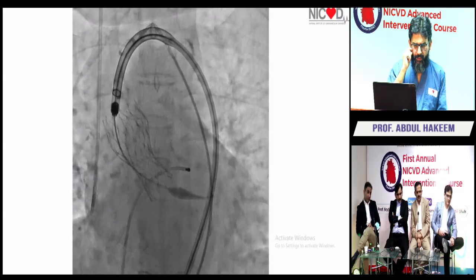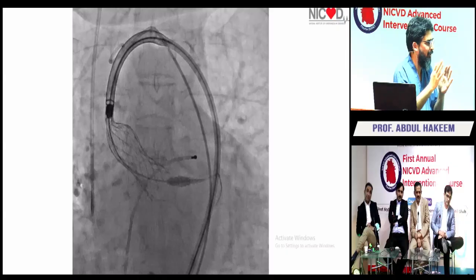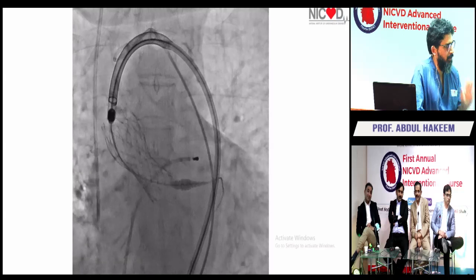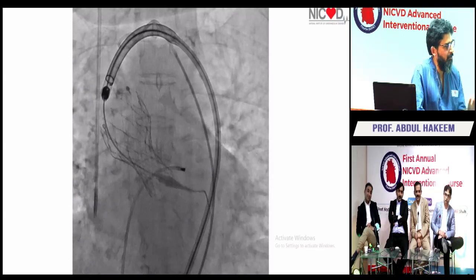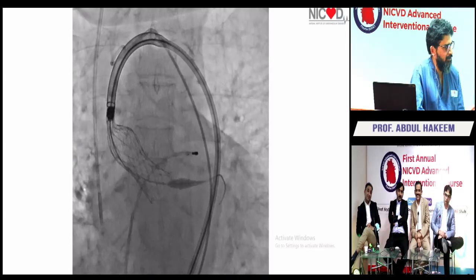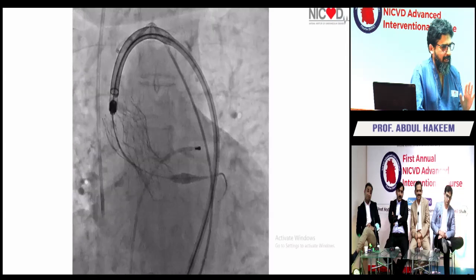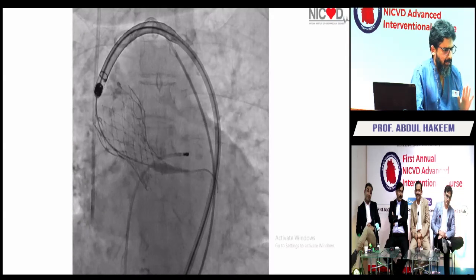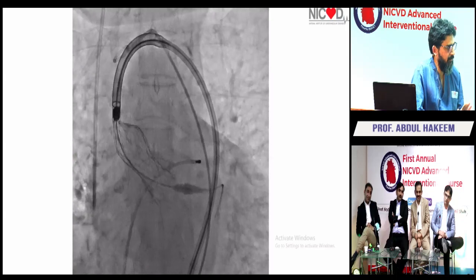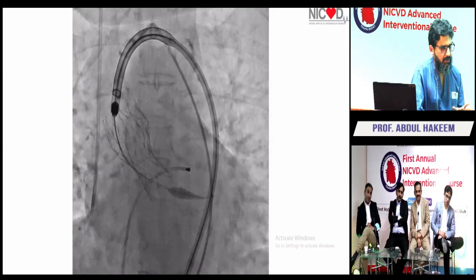So again, I think it was fairly straightforward. Again, this is, to me, the most important step, okay? Regardless of how experienced you are, I will tell you, I know people who've done, Jeff Popma has probably done more Evoluts than anyone else in the world. He's probably done a couple of thousands, okay? And he says to this day, this is the part that he's most scared of, is how to release the valve. Because understand, it's a self-expanding platform. It continues to expand.